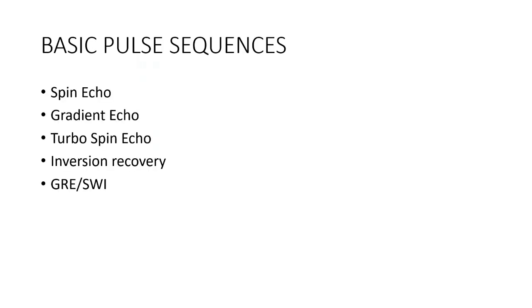Coming to the basic pulse sequences, I'll be telling about spin echo sequence, gradient echo, then turbo spin echo, then inversion recovery, which includes STIR and FLAIR images, then susceptibility weighted image.